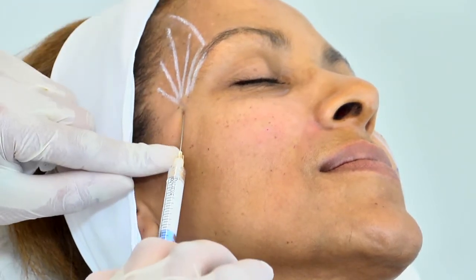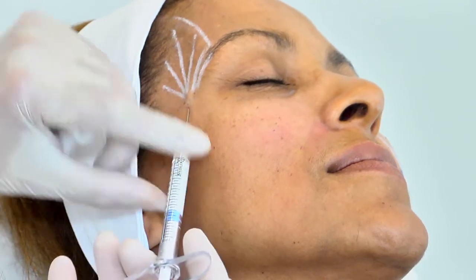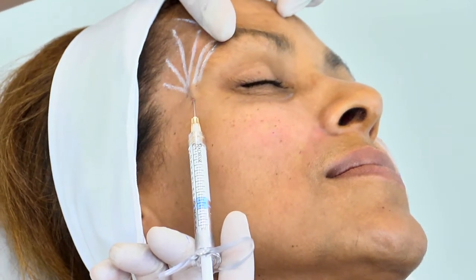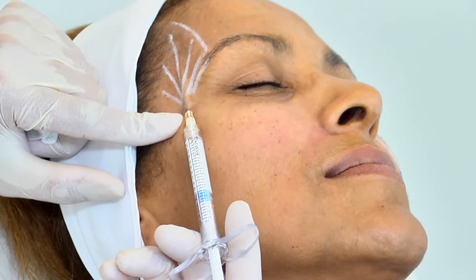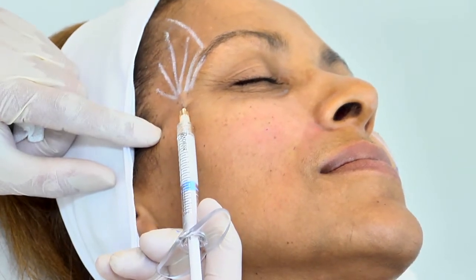Cannula injections through the deep temporal membrane and temporal muscle can be painful. Go until hitting the bone. A small aspiration can be made to ensure that it is not in a deep temporal branch. Massage and shape the zone injected to evenly spread the product.